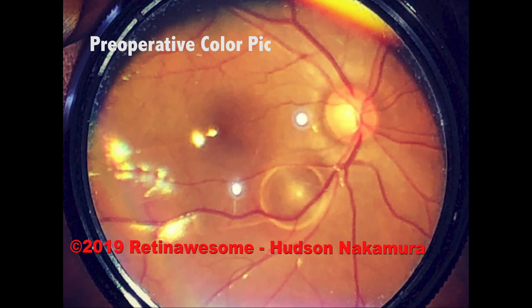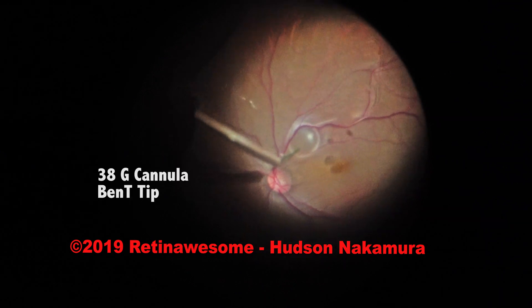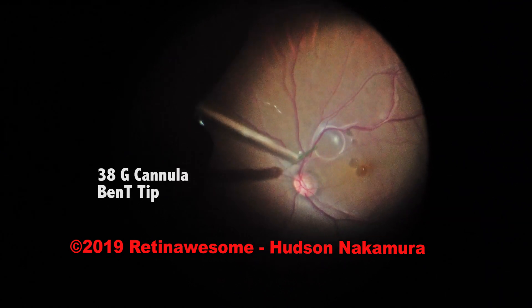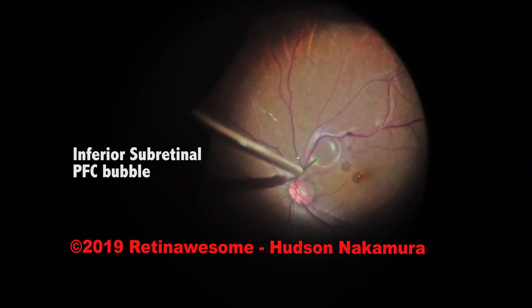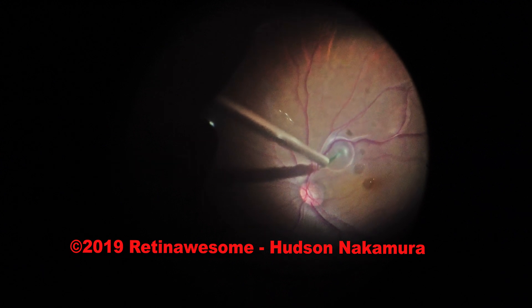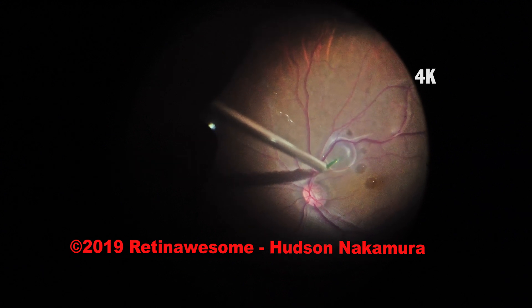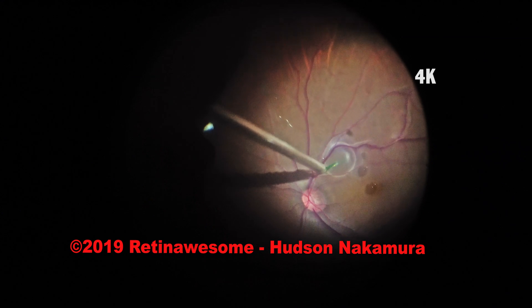This is the preoperative retinal pic. We start the case with a very low BSS infusion to avoid silicone oil leaking through the sclerotomies. The procedure needs to be performed fast, otherwise we lose intraocular pressure, silicone oil, and the media can get very hazy.